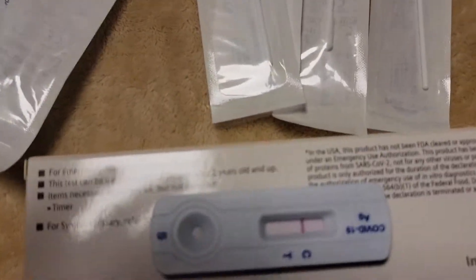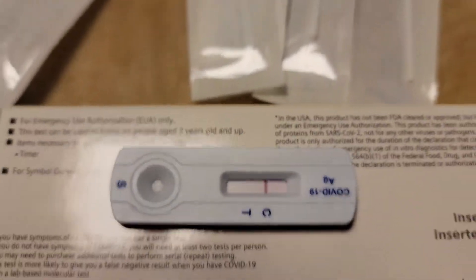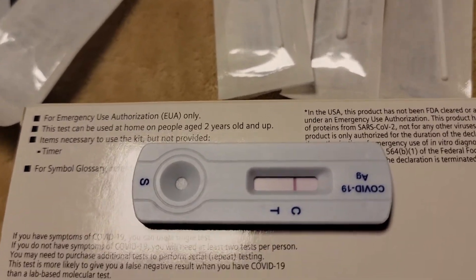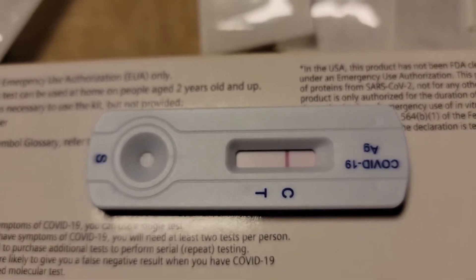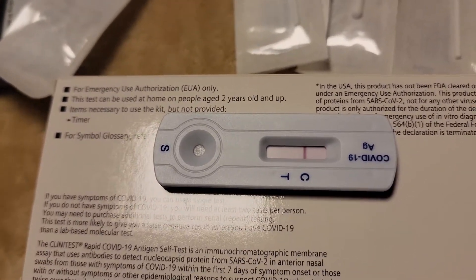All right, there you go. 8:13. We'll go check out our test. So C. It says to look carefully for the T, if there's another line there, even a very, very faint one, then you're positive. If it's C, it's a negative. So that's good.